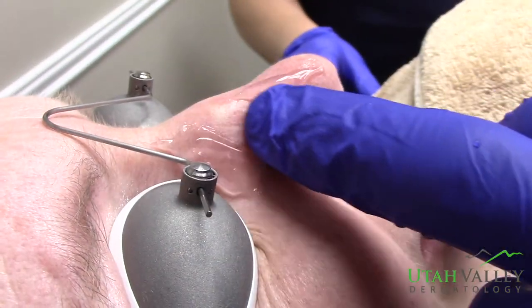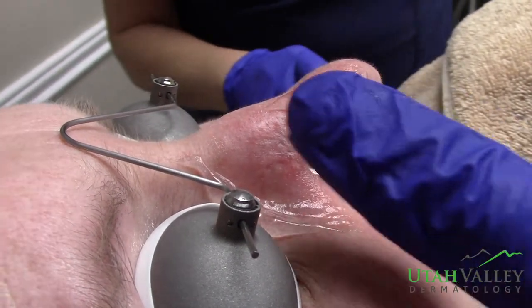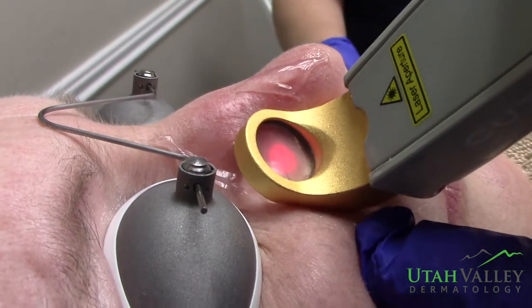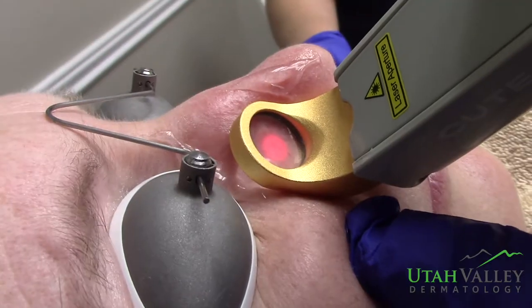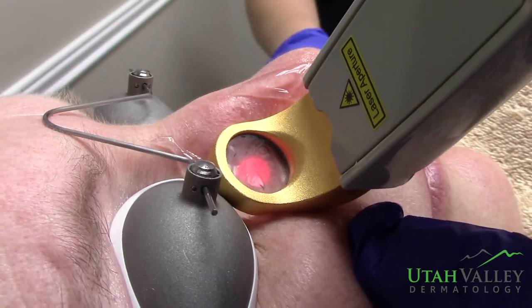You can already see a lot of that's calmed down the blood vessels. I can see just a few others that we're going to do here. One, two, three. One, two, three.